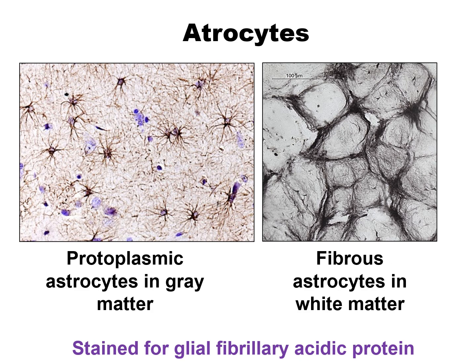The supporting cells of the central nervous system, in the cerebral cortex and cerebellar cortex. Already we have identified, under the nissl stain, some small nuclei without the cytoplasm. Those are the glial cells. The glial cells can be studied with some special stain. They contain a protein called glial fibrillary acidic protein, GFAP.